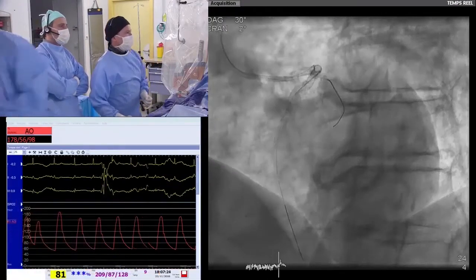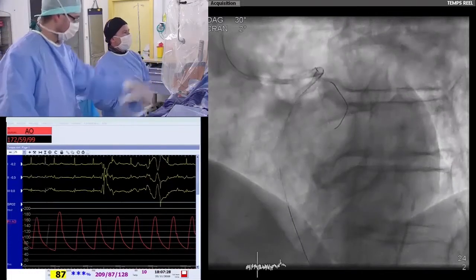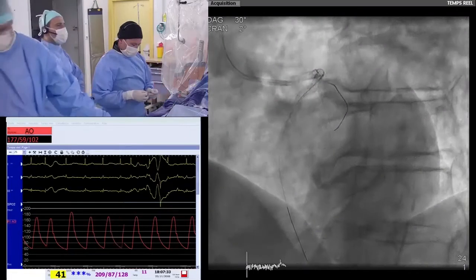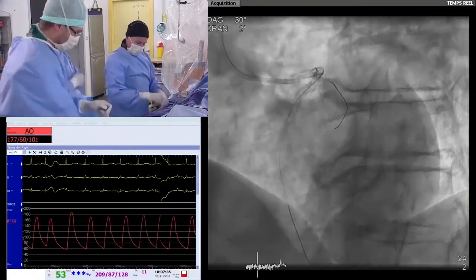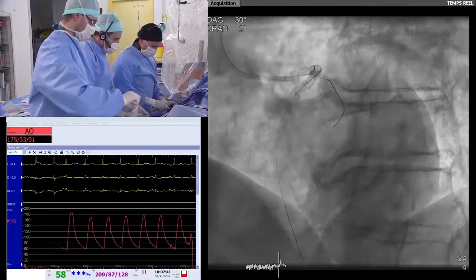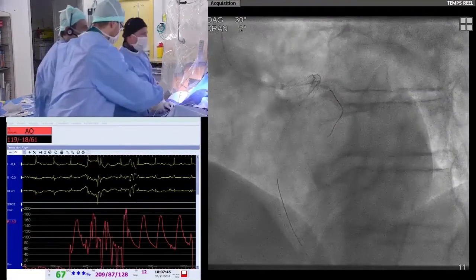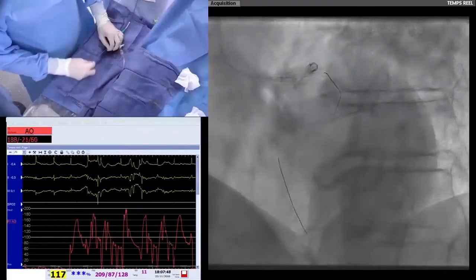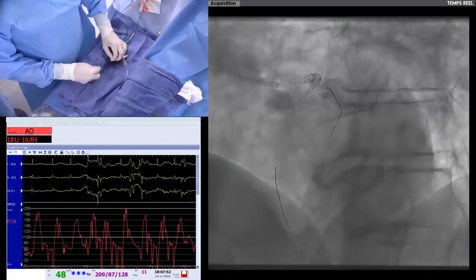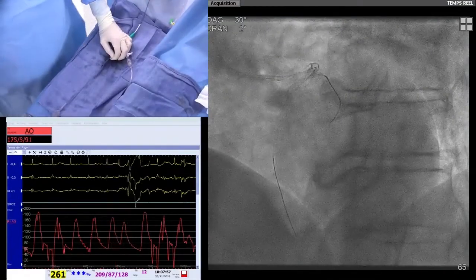Okay. I am coaxial with the stent, and I think there is no longitudinal compression. This is okay. So I will engage slowly a balloon inside the proximal LAD just before the diagonal to perform a POT, proximal optimization, a post dilatation inside the stent between the ostial LAD and the diagonal. So now slowly I engage the balloon inside the left main and the LAD, and then I will change the view. 3.5 non-compliant balloon, Didier.